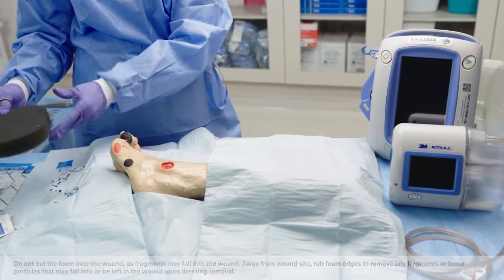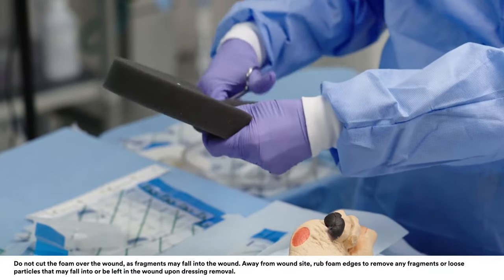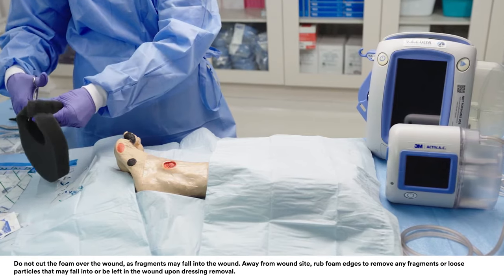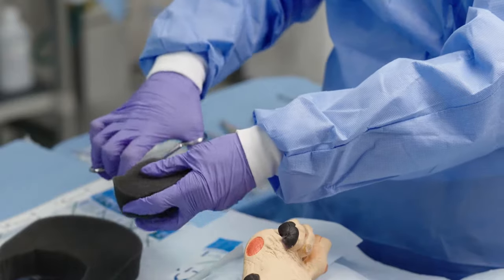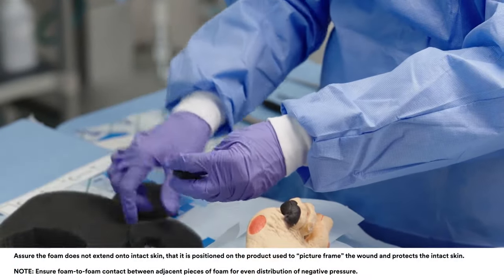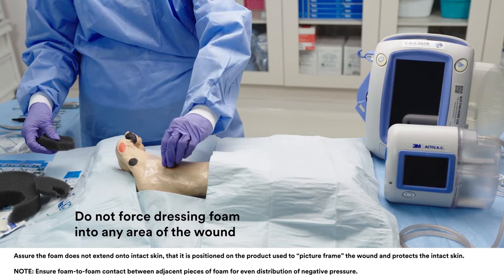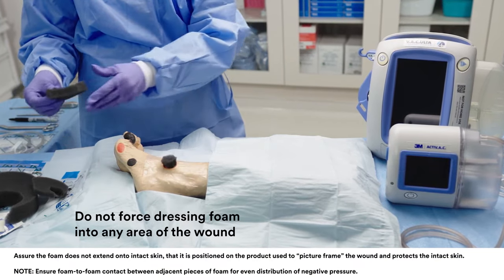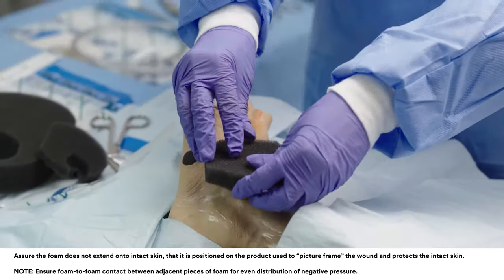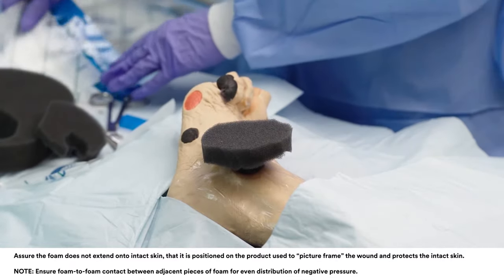Cut dressing foam to dimensions that will allow the foam to be placed gently into the wound, but not overlap onto intact skin. Gently place the foam into the wound cavity, ensuring contact with all wound surfaces. To accommodate the size of the SensorTrack pad, cut another piece of foam large enough to extend 2 to 3 cm beyond the SensorTrack pad and lay the foam in the wound.